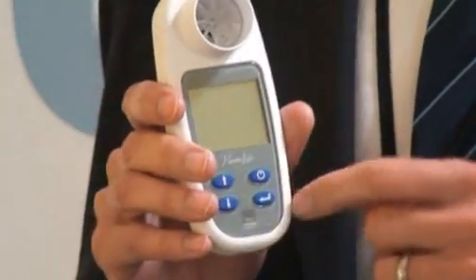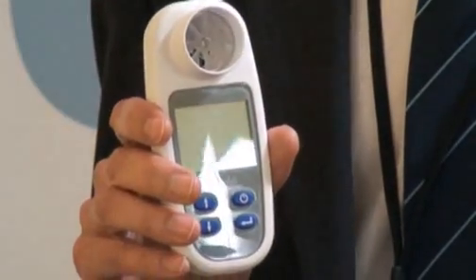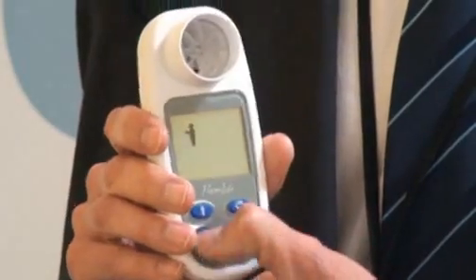Very simple to use. The on/off key is here. If we switch it on, the device will beep and it comes up with a picture of a man — basically this is to choose between male or female.